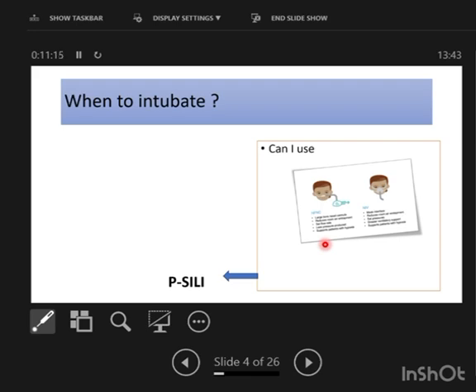So you have to see how sick your patient is. The sicker the patient, the more definitive the steps you have to take. So if your patient's inotropic requirement is very high and his ABG is showing severe acidosis, your trial of all these non-invasive ventilation should be restricted to 2 hours. You see the result. If it's not improving, go for invasive ventilation. Don't shy away from invasive ventilation. That is the organ support that is required. So these clinical decisions you have to take at the bedside. That is what is important in ventilating a septic shock patient.